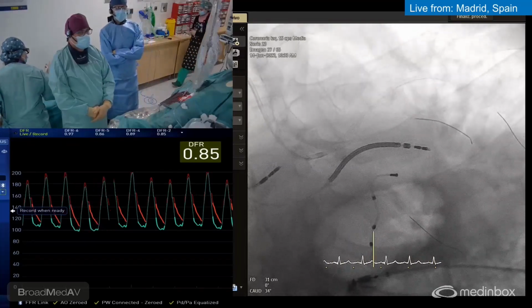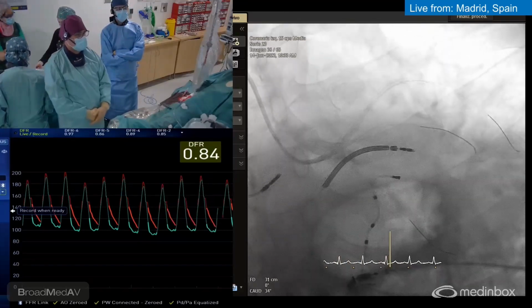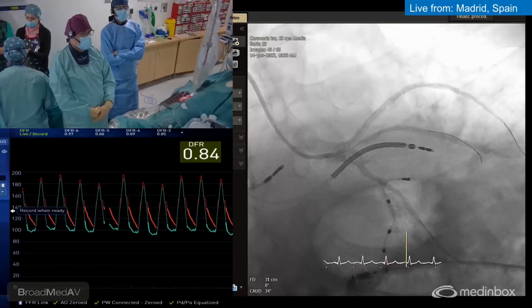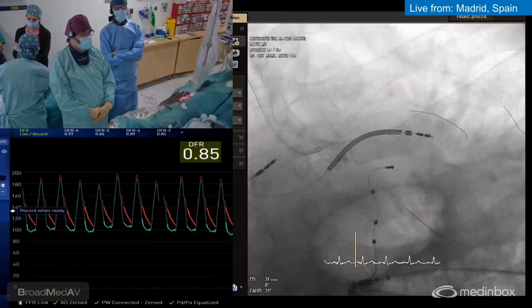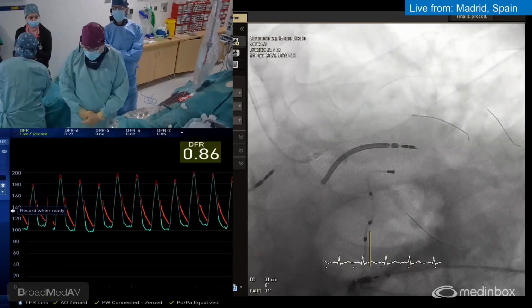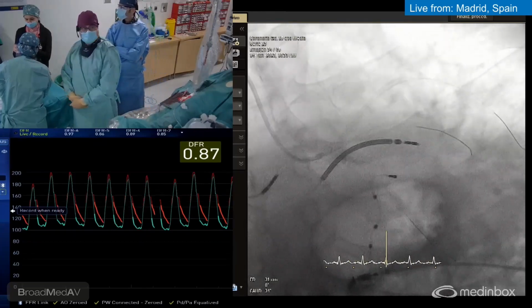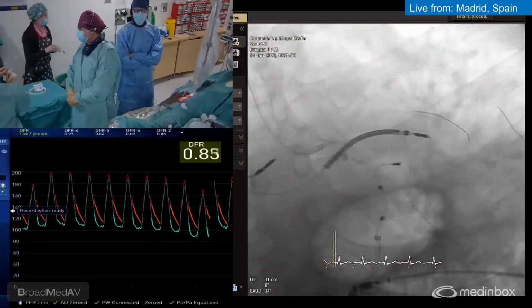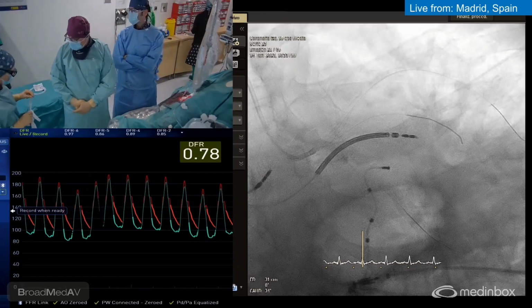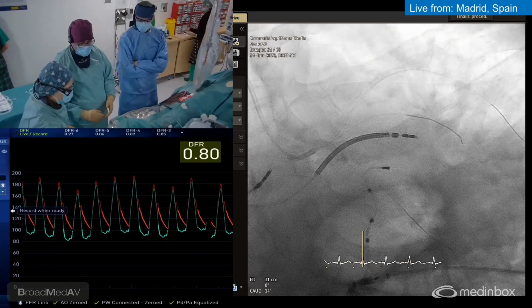Yeah. But I don't know the pullback. When you do the pullback, the point is the ostium. The problem is the thing I was saying before. This is not black or white. Some colleagues of us said no, it's 0.88, we need to treat it. It's 0.90 or 91, we don't need to treat it. And in this case, probably the ischemia is not the problem, the patient is asymptomatic. We need to remember it. The ventricular dysfunction is multifactorial, probably. So let's do that.